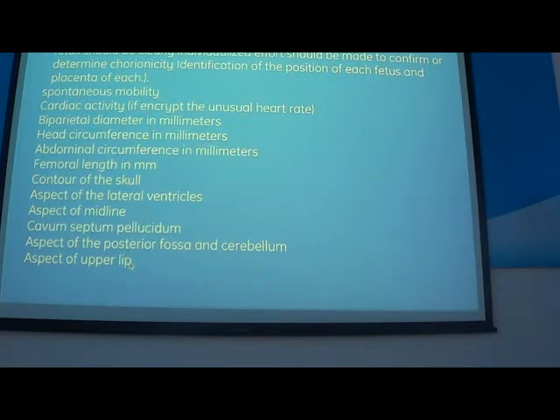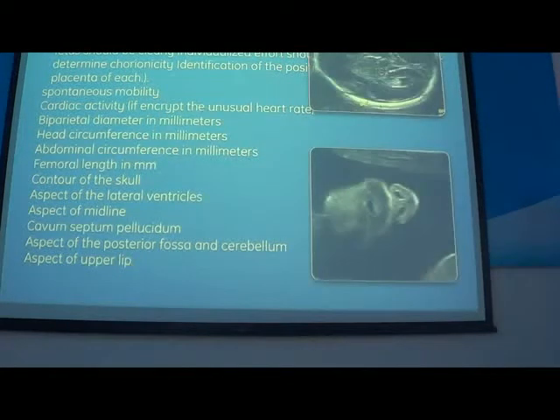And we have to give two pictures. This one with the parietal measurement. Đây là hình ảnh đo đường kính lưỡng đỉnh. And this one with a view of the nose, nostril and the lips. Đây là hình ảnh mũi, lỗ mũi và môi trên. And this is a basic first level examination, but we don't have to do the profile view. Và đây là những cái hình ảnh cơ bản mà chúng ta không nhất thiết phải làm cái hình ảnh profile. These are the basic recommendation. Đây là hình ảnh khuyến cáo của Hội Sản phụ khoa Pháp.